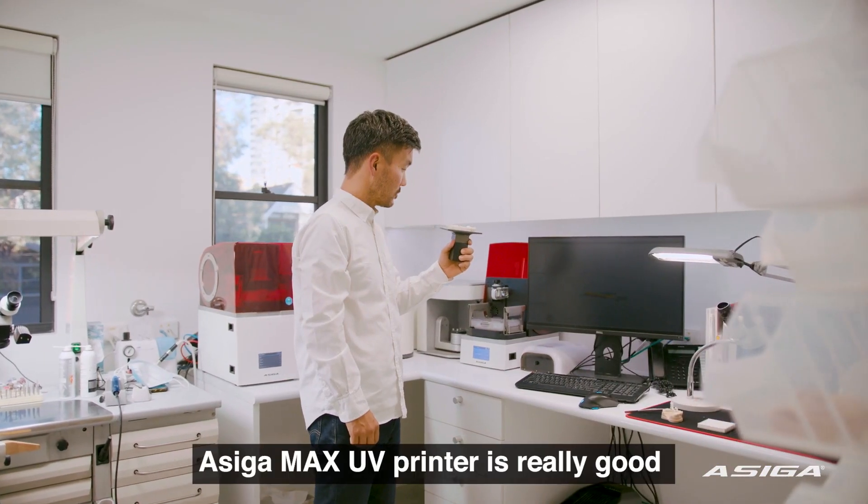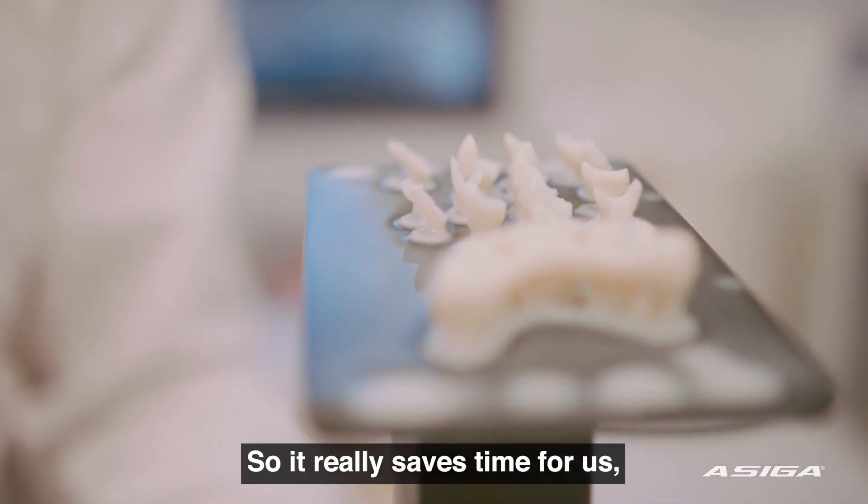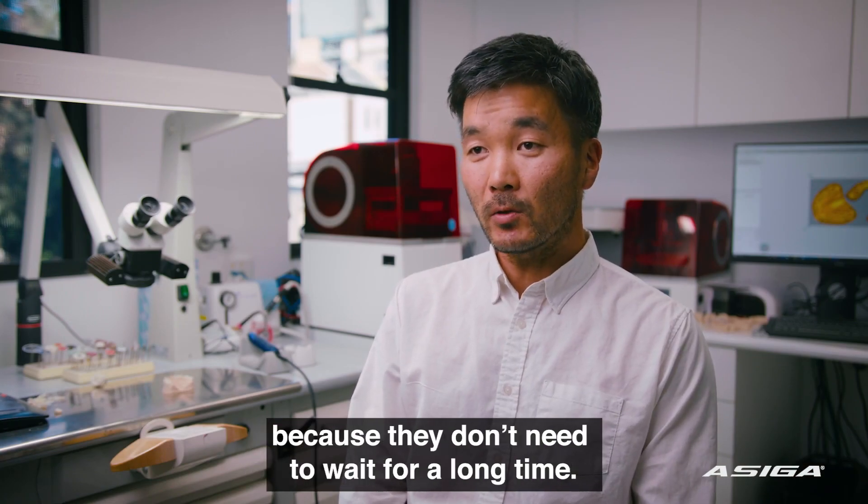We can send off for the design, the technician can send it back to us and we can just print it literally in an hour. Asiga Max UV printing is really good, very speedy. It's really saved time for us and it's good for the patient because they don't need to wait a long time.